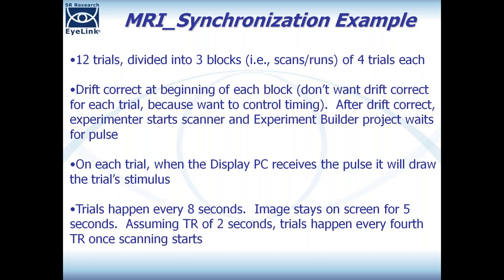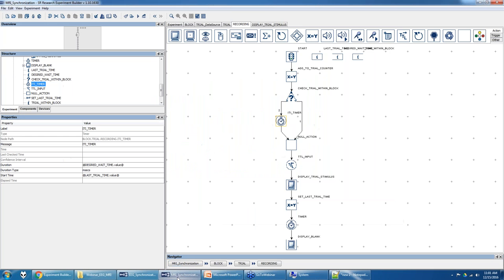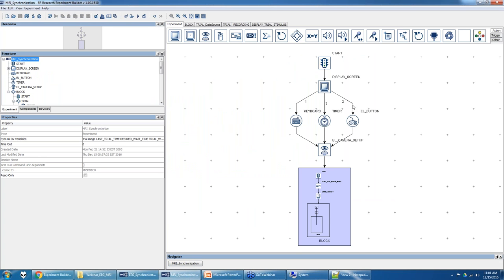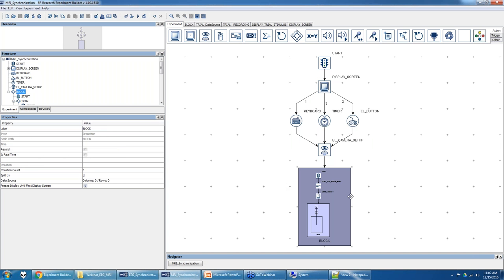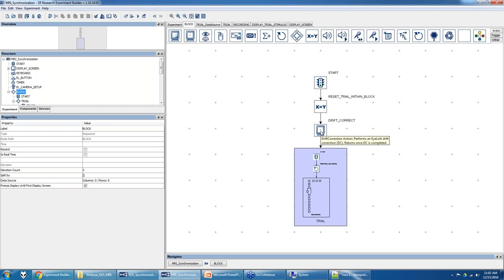Let's look at the MRI example. At the top level, it looks a lot like the EEG example — sends some instructions, presents instructions, goes into camera setup mode. The difference is that we then go into a block sequence with an iteration count of three, meaning we do three different blocks. At the beginning of each block, we do a drift check when the scanner is not running, making sure calibration accuracy is still good and recalibrating if needed.